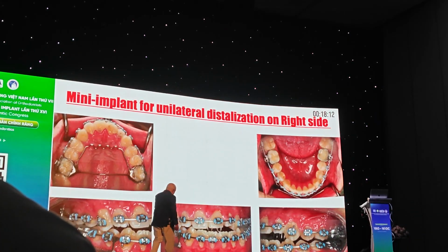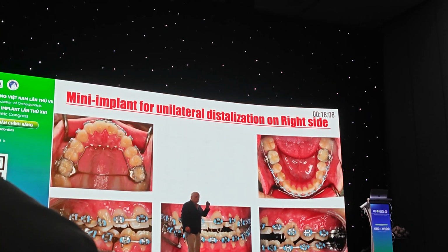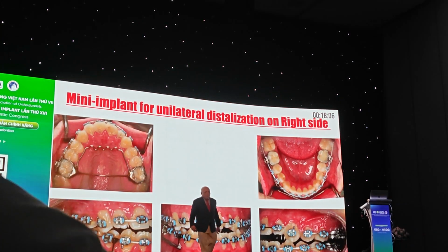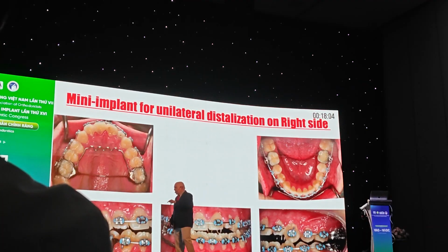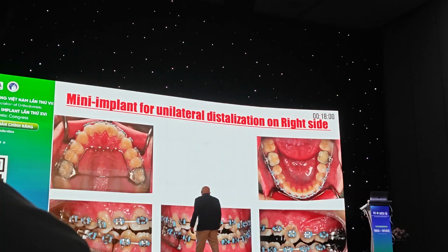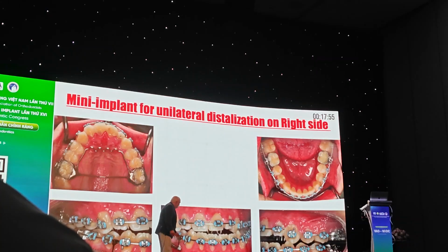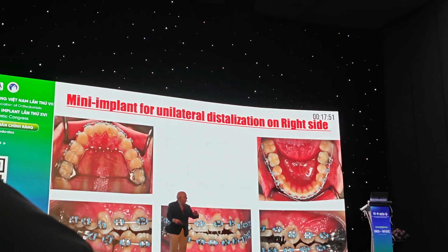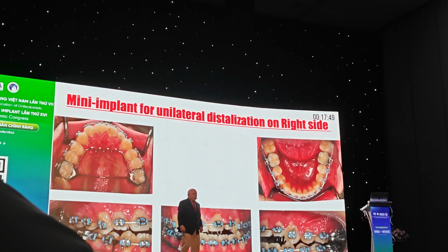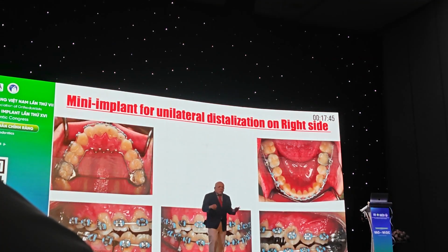All open bite patients are going to receive some kind of a tongue crib in the back. I don't like spikes. I like nice rounded things so that they just remind the tongue not to go back. We are going to use the same heavy arch wire. We are going to use a hook on one side, and what we are going to do is basically change the arch. And you can see no treatment is going on in the upper, just the buccal segment and anterior segment. Nothing in the upper.